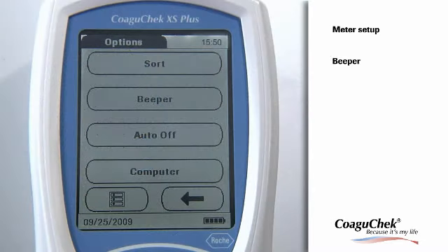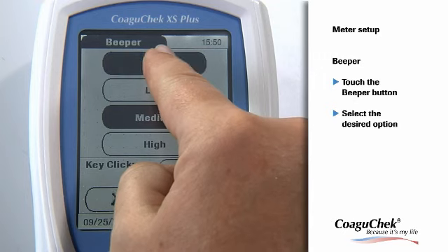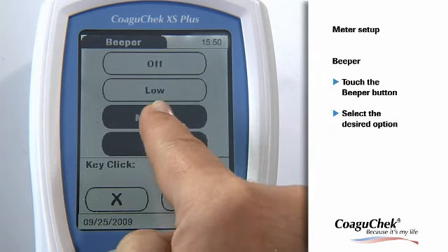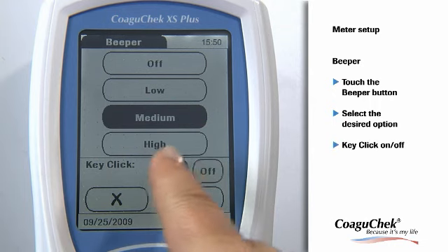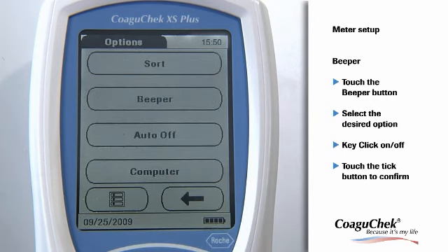Now you can choose whether you want the beeper off or adjust its volume. When the beeper is activated, the meter alerts you to special circumstances with a beep tone. Select the desired volume of the beeper alert. When the key click is activated, the meter clicks when you press any button of the touch screen interface. Touch the Tick button to confirm. The program automatically returns to the Options menu.